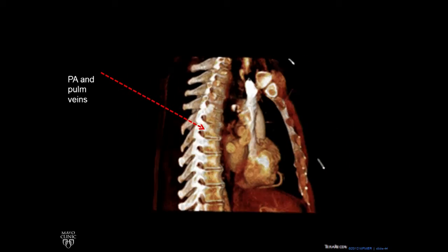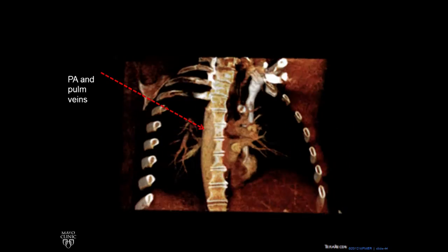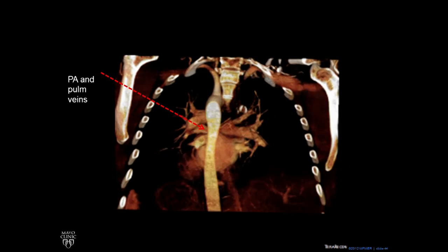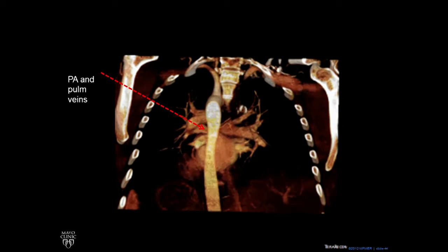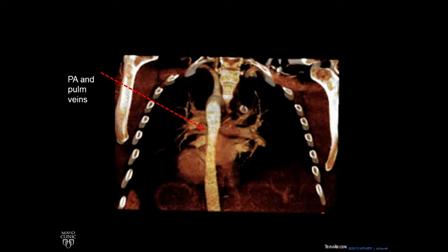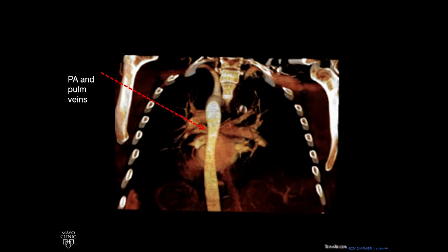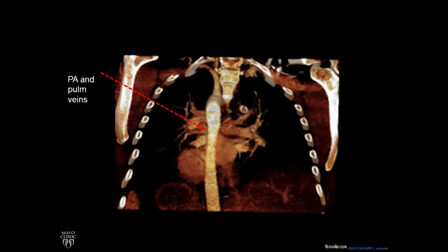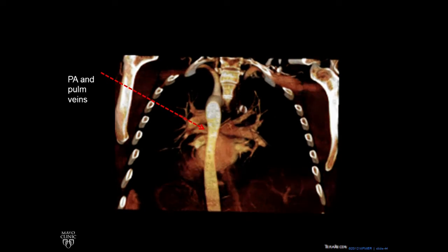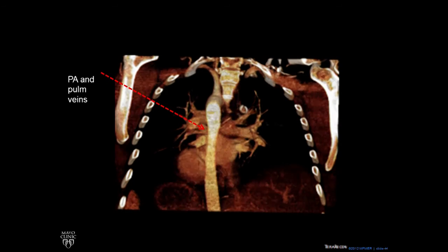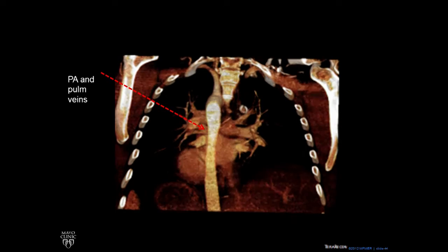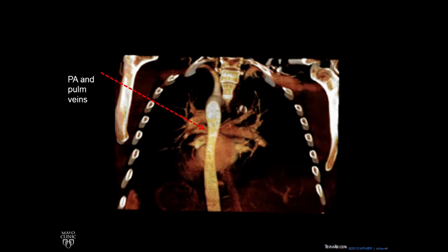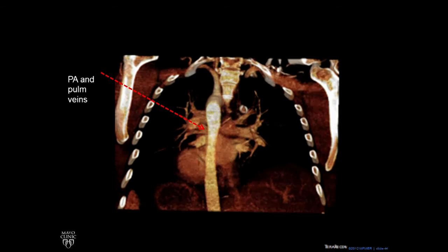Let's rotate around and look at the back. Now it's on your right-hand side. Going from the top, we see a little circle which is the azygous vein, we see the pulmonary arteries, and below it we see these veins draining into the left atrium.